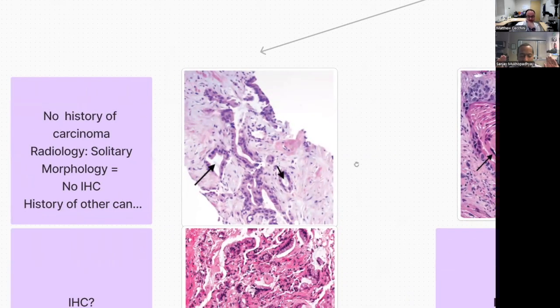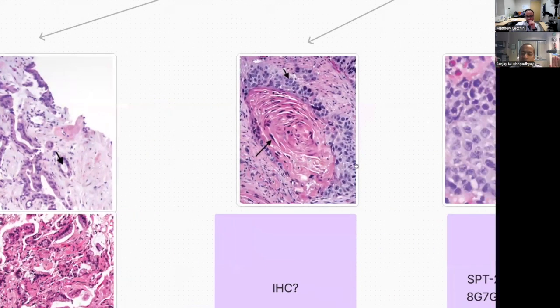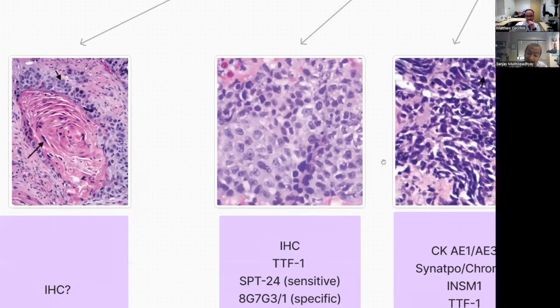So I think you should never do it. In a clear-cut keratinizing squamous, there is zero need to do it, and you should never do it. It will get you into trouble because it will stain focally positive once in a while and is of no use. In the next case, you have to ask yourself, will I believe it if it's positive?